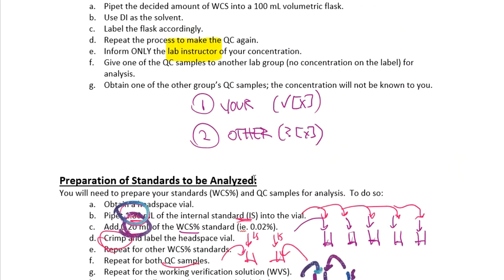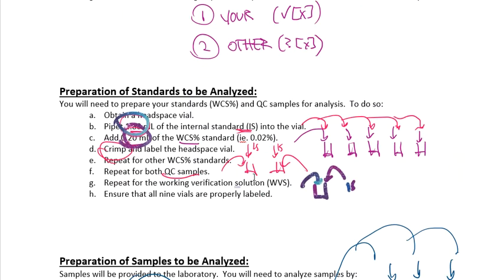And this is the preparation of the standards. A lot of things going on here. And that is one of the reasons that we wanted you to work in a group and not by yourself. Share the responsibility. Make sure that you do the entire set in completion.